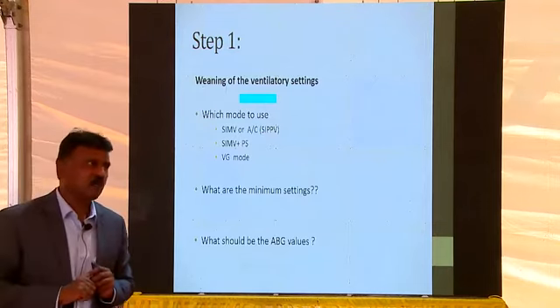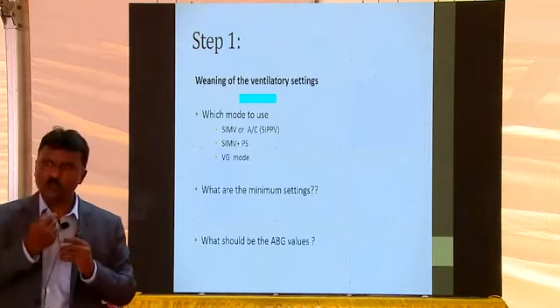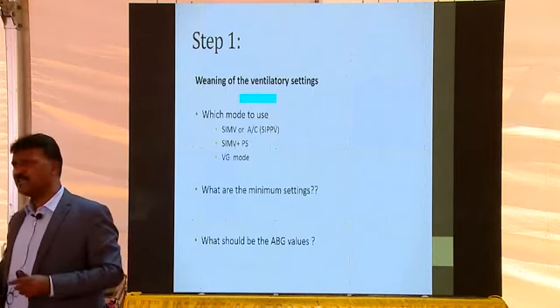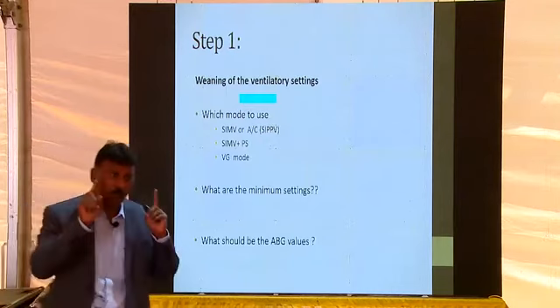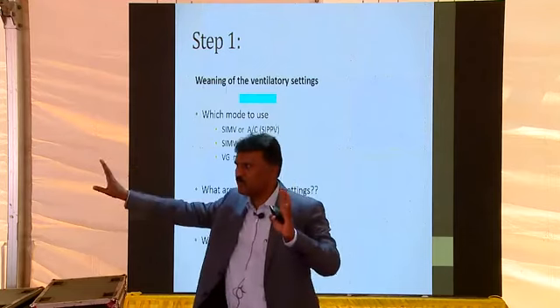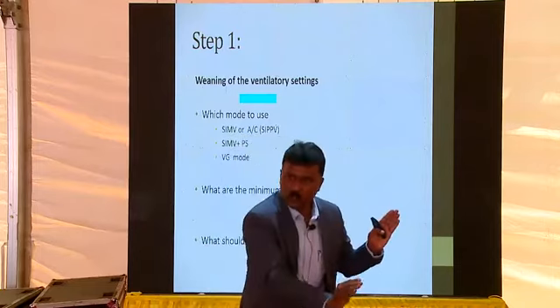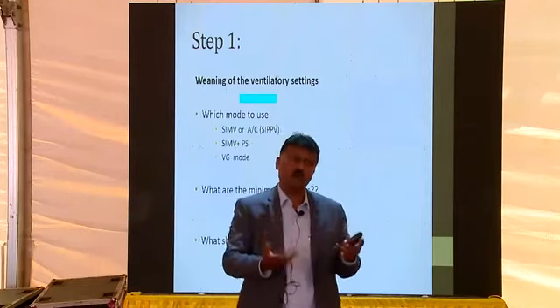now 40 breaths, he's breathing on his own. Not increasing the work of breathing, because he's breathing support breath or assisted breath. You didn't come down on his own breath. He's still breathing 60. Now you have brought it down to 20 breaths, and now out of his 60, 40 are unsupported. People are worried maybe this increases the work of breathing.